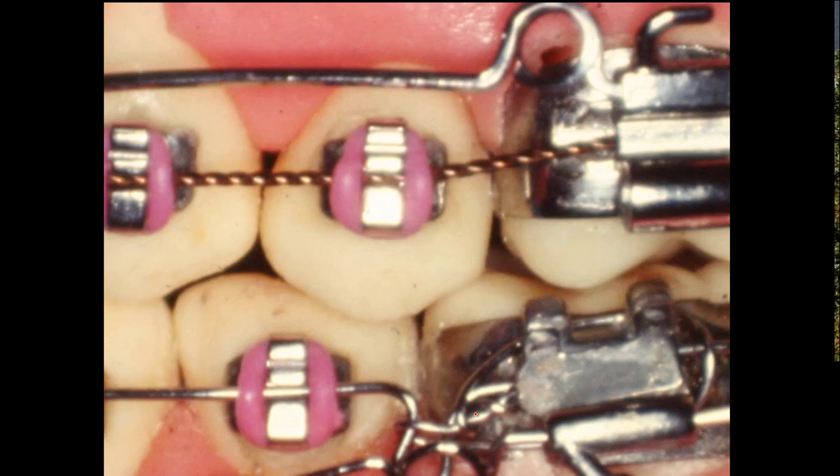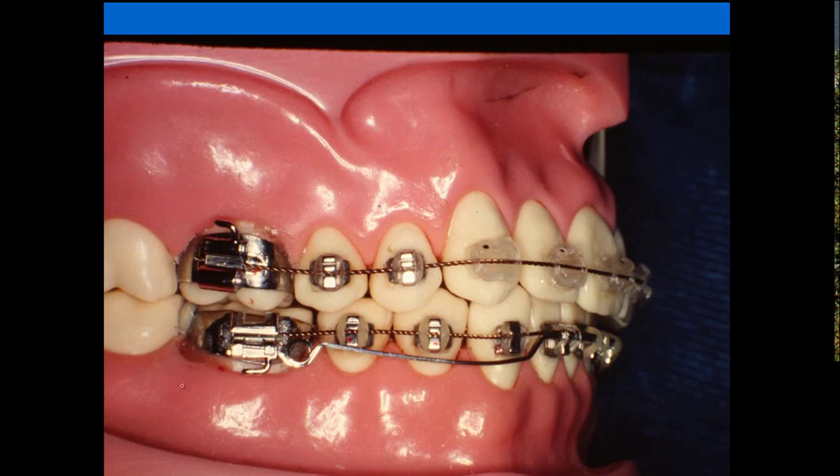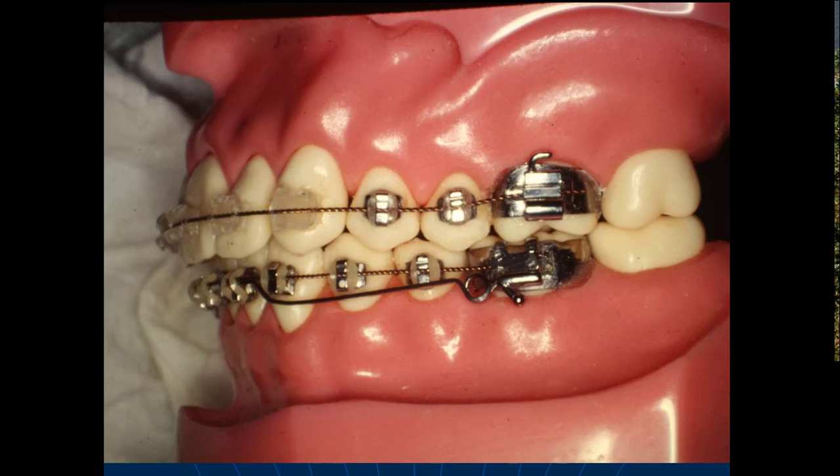So you won't have to use this torque very often, but you need to know how to do it. Now this shows you the tie back again a little closer to give you an idea of how to do it. You put your driver in here and shove this back real hard, and tighten this wire up real good. You can close the spaces in the teeth — you can pull them together with that tie back on the arch wire, and we use it frequently.